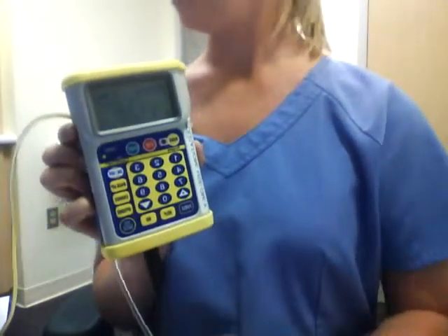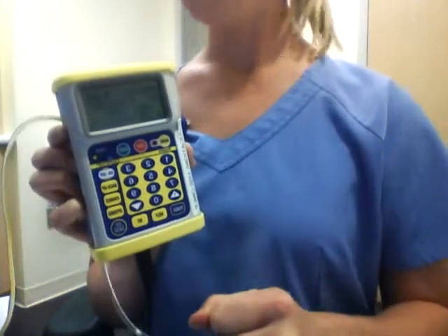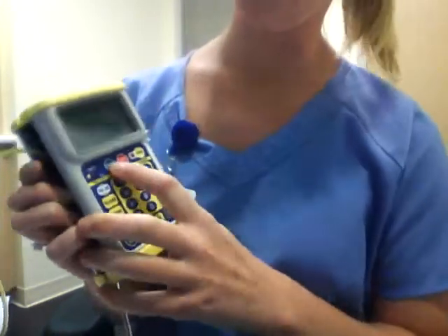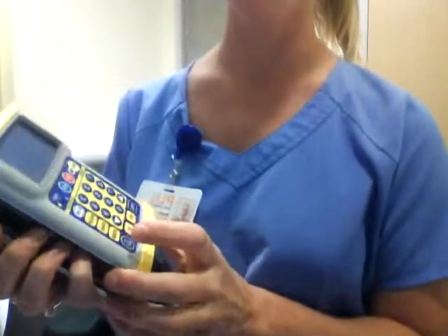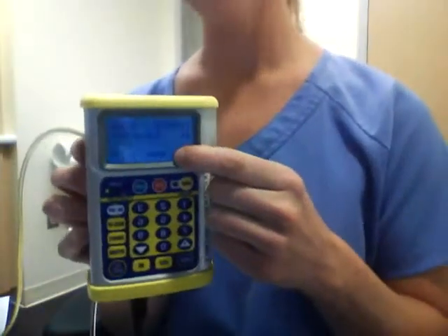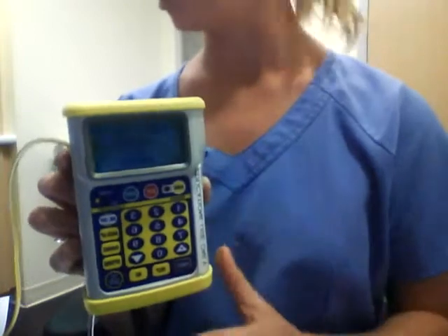Then you can reconnect the pump to the patient and all you have to do is press the start button to begin the infusion. You know the infusion has begun when the arrows move across the bottom of the screen.